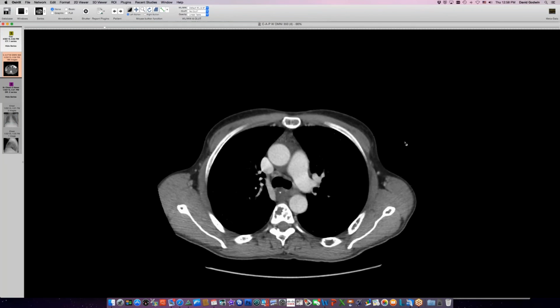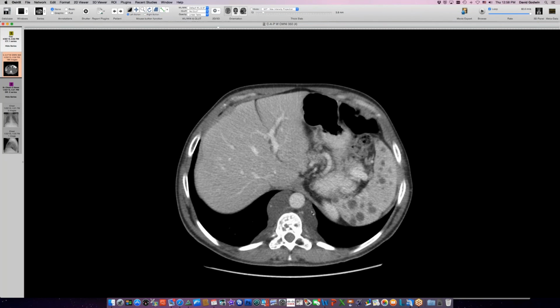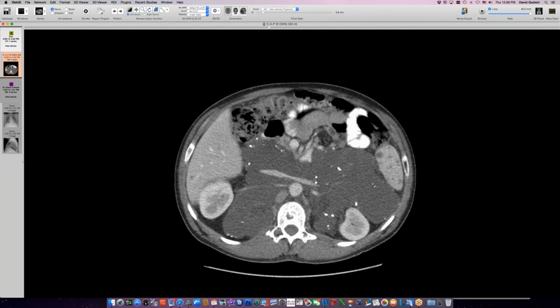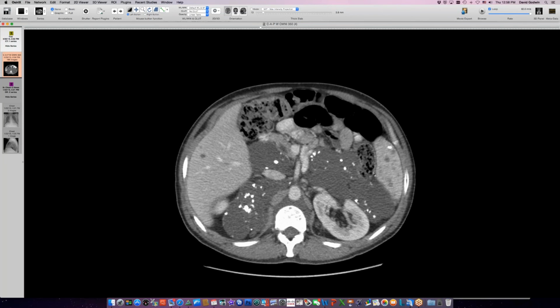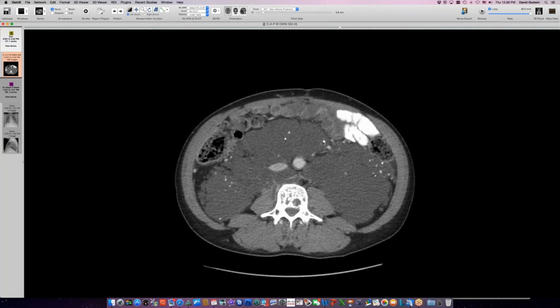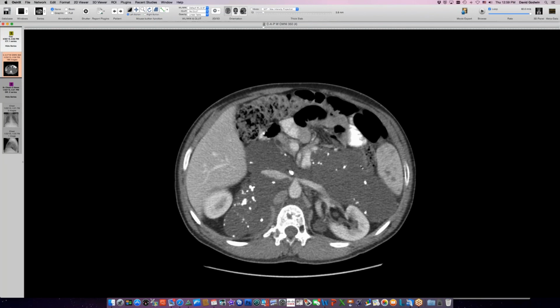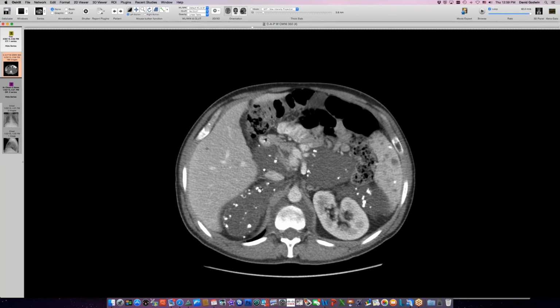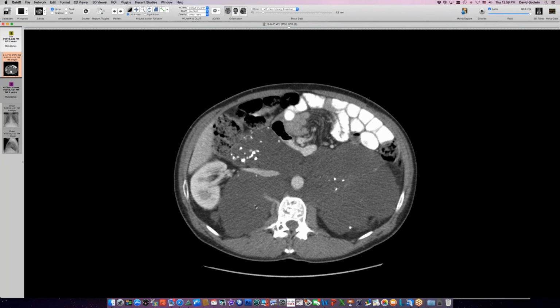And this is what his CT scan looks like. He's got this low attenuation mediastinal mass, paraspinal masses, things in his spleen, and then a huge abdominal mass here with nice little calcifications in it. This is a case of lymphangiomatosis. So this fellow has had this from childhood, these big lymphangioma collections in his body here, and there's probably a hemangio component. And these calcifications are probably phleboliths associated with that. So they can be combined: lymphangio, hemangio, or hemangiolymphangiomas.